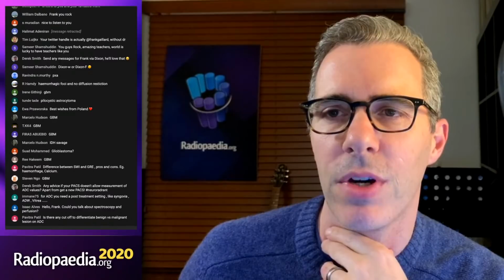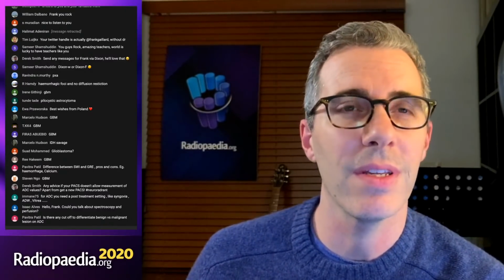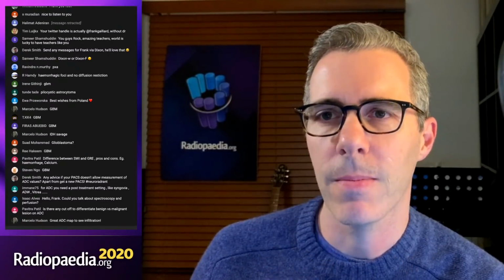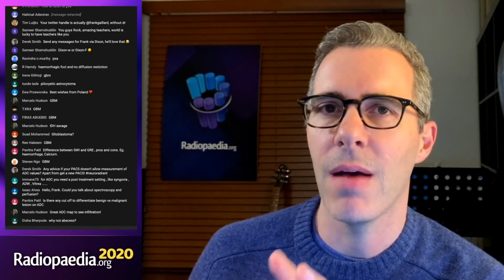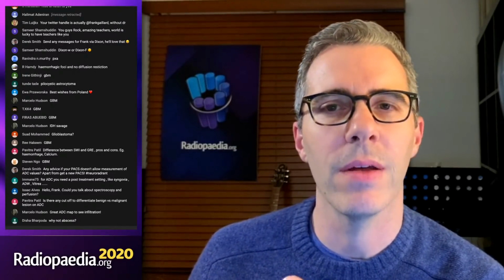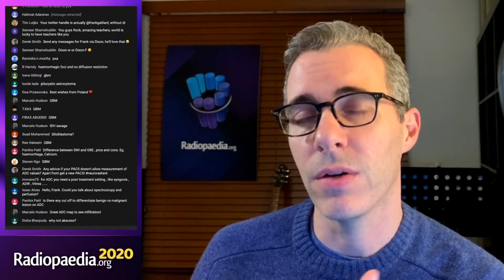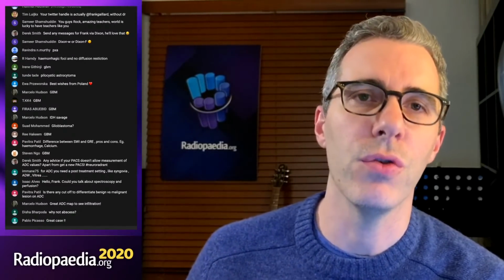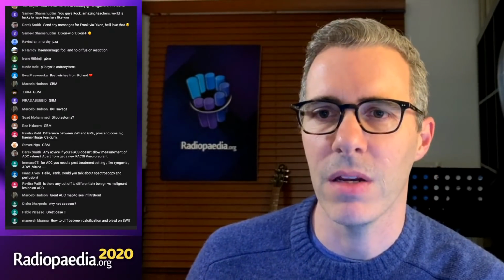And hemorrhagic foci, no diffusion restriction, correct. So pilocytic astrocytoma is a good thought. He's 50, which is pushing it age-wise. Usually when you see pilocytic astrocytomas in adults, they are more unusual in appearance and could certainly look like this. They're often periventricular or around the base of the skull, optic radiations. They tend to be more aggressive. But that's not a bad thought, along with other unusual gliomas such as a parenchymal ependymoma, for example, but you don't see very many of those.